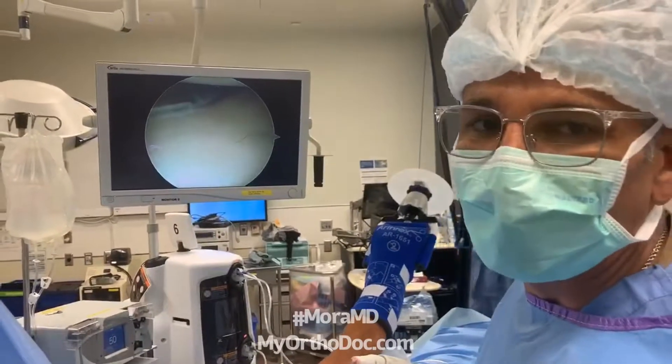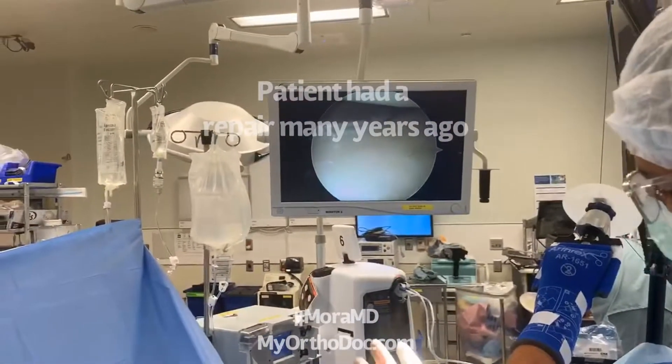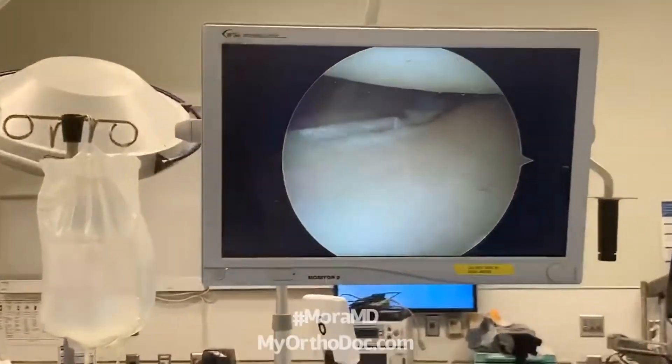This is called a revision rotator cuff repair — revision rotator cuff repair, right shoulder. The patient had surgery done in the past. Right shoulder, patient lying on the side, looking away from me. Monitor, monitor.